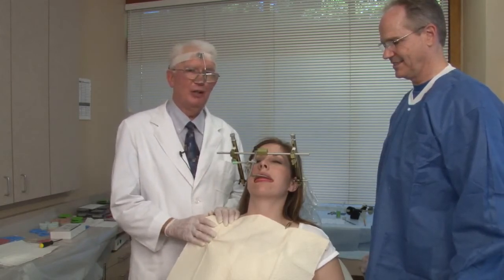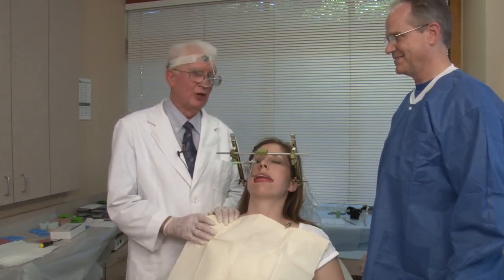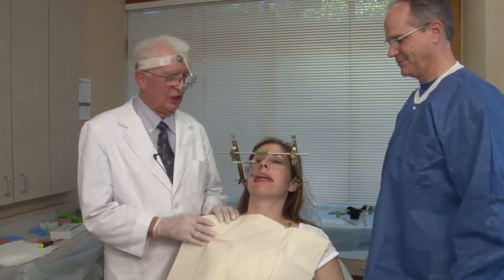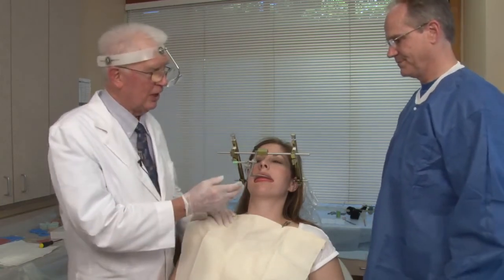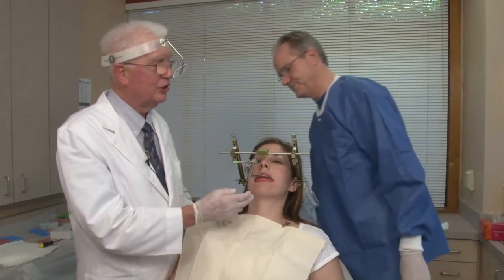Mills how the AD2 equipment works, and I've now recruited him to do a little work. He's just been sitting and watching, so it's time for him to work. So he'll be doing the left side while I'm doing the right side. We've put the bite fork on. The pink wax is holding the mandible in centric relation.